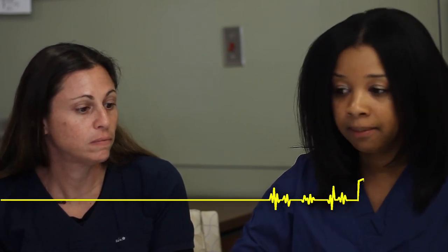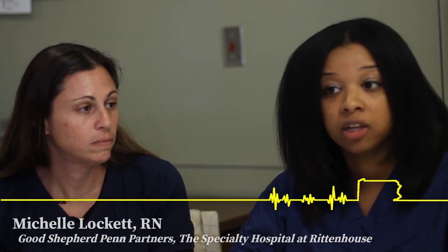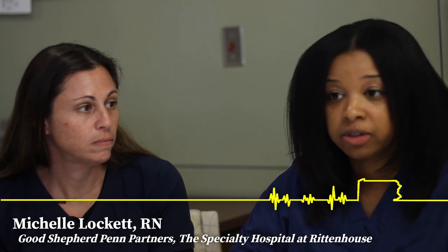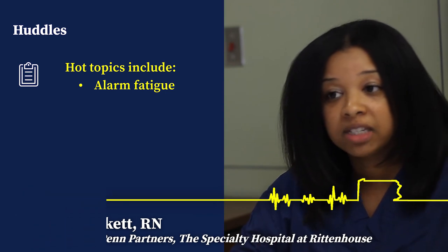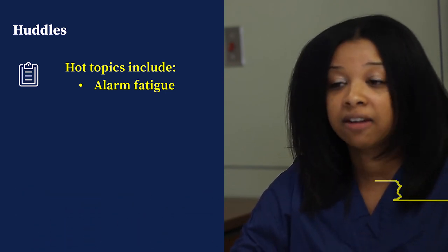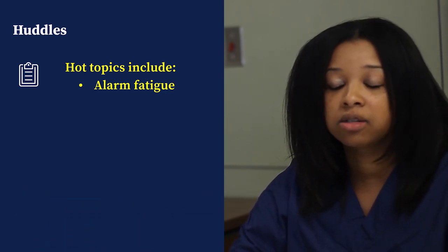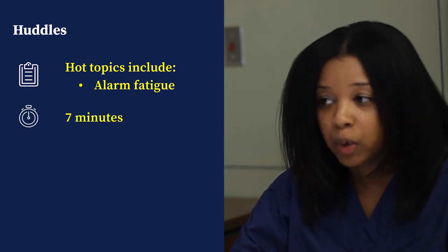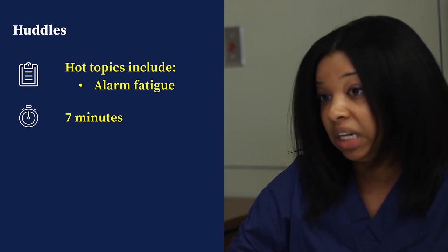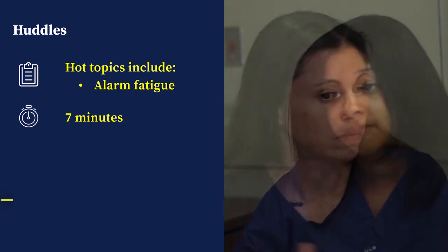Our huddles are something that the charge nurse does at 11 a.m. We gather our staff, all of our staff, from nurses, respiratory, and CNAs, and we talk about hot topics. And the alarm fatigue education is definitely one of our hot topics. Huddles are only about 7 minutes long, so we like to get in, get the hot topics going, have any questions if needed, and then get out and continue our day.